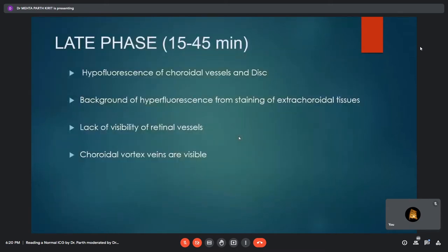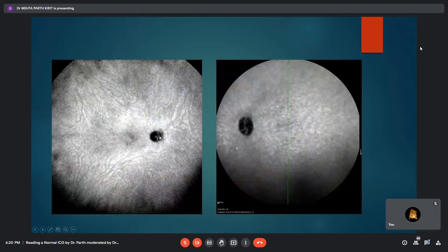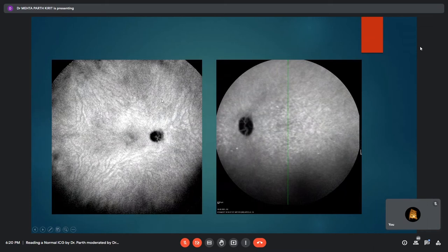In the late phase of ICG, lasting 15 to 45 minutes, there is marked hypofluorescence of the choroidal vessels and disc, a background of hyperfluorescence from staining of extrachoroidal tissues, and lack of visibility of retinal vessels. Choroidal vortex veins may still be visible. The late-phase ICG angiogram demonstrates hypofluorescent optic disc and silhouetting of the larger relatively hypofluorescent choroidal vessels against the background fluorescence due to staining of the extrachoroidal space.